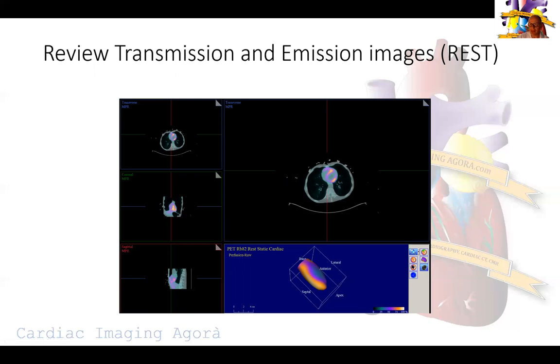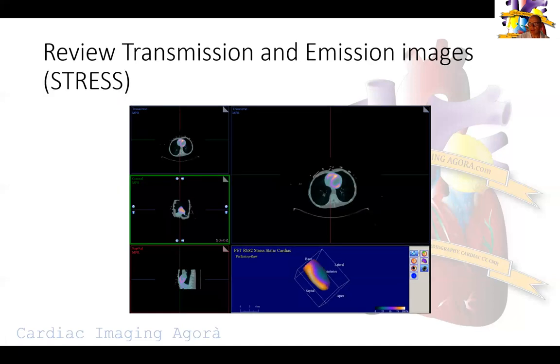At our institution we use regadenosine and we've been using it for years. These are the rest images. The importance of the transmission and emission images is to make sure we have proper alignment of the myocardium at rest and stress. Sometimes it's very difficult, especially if you have a defect, to figure out where the myocardium ends and how to superimpose it on the CT images. I use the RV as a landmark to align the myocardium, which aligns everything else.